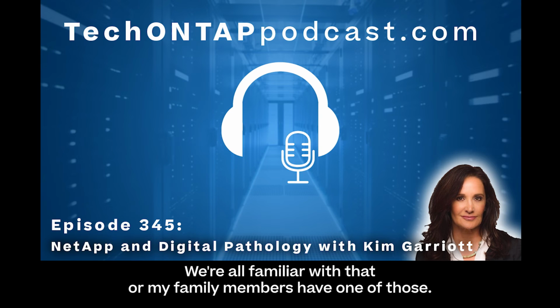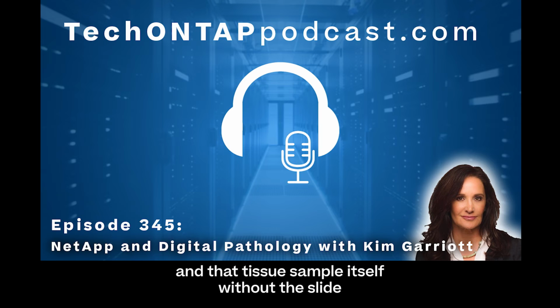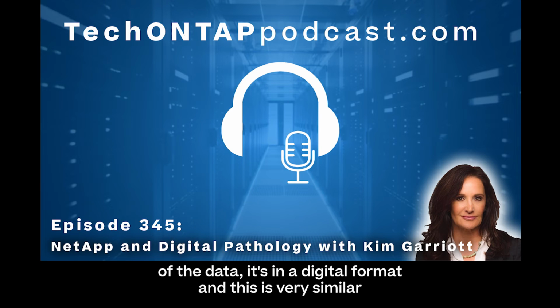We're all maybe familiar with that, or have family members who have one of those. We have small CT scanners now that can sit on a countertop, and the tissue sample itself, without the slide, can be scanned by these micro CT scanners. And so from the original acquisition, the data is in a digital format.